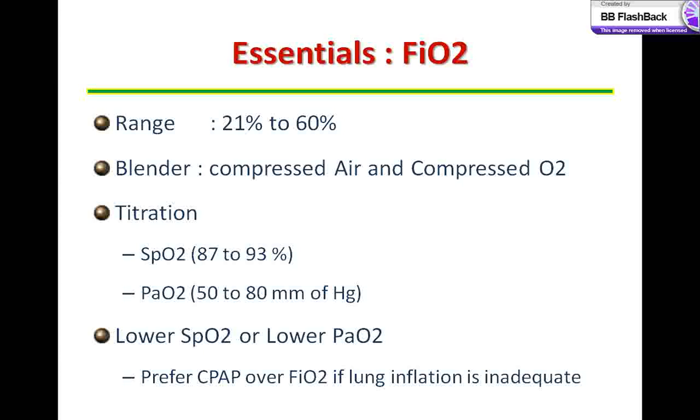When the baby is having saturation less than 87% and has increased retraction, one would increase the pressure, that is CPAP, rather than the FiO2. On the contrary, if there are no retractions but saturations are less than 87%, one would increase the FiO2 and not the pressure.